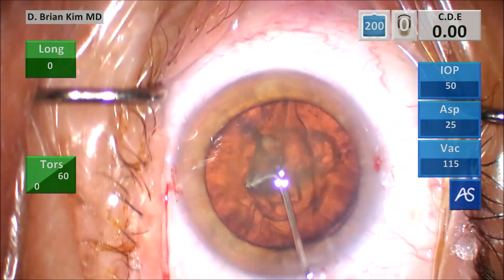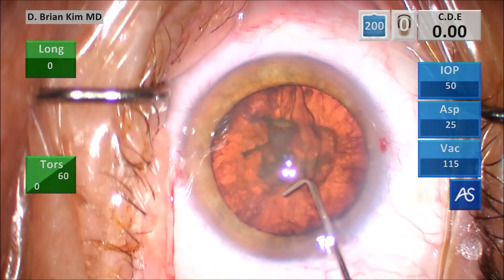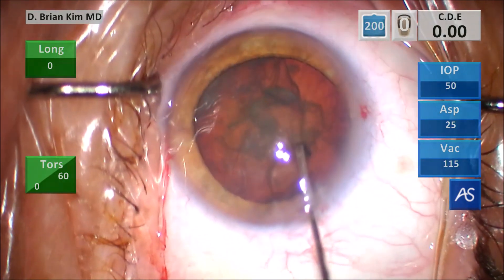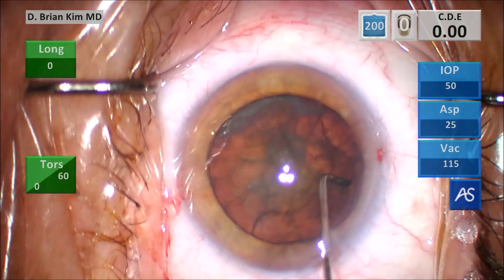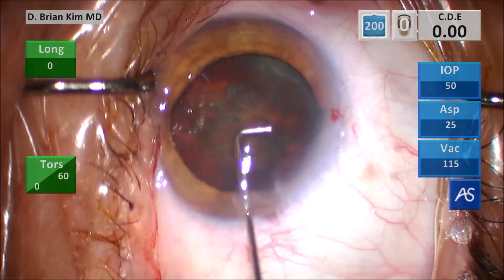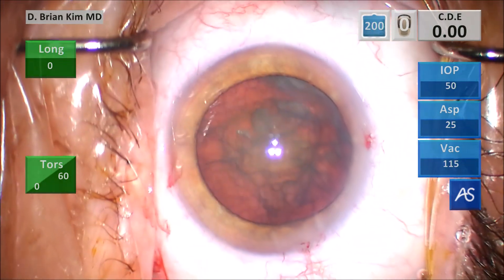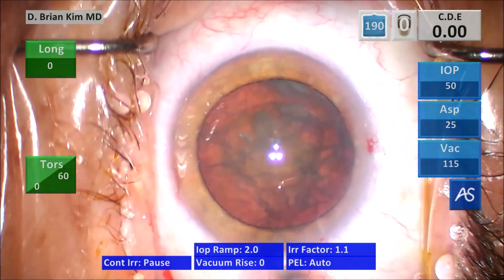I go ahead and decompress the bag after hydrodissection, very carefully sweeping under the rhexis edge. I'm not going to be overly aggressive trying to turn the lens. This is the type of case where you don't want to be aggressive when you turn the lens because you can actually rip the zonules. All of these cases just require attention to detail and acute awareness of your surroundings, particularly when dealing with zonular weakness.